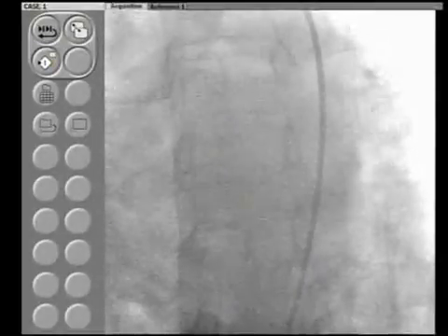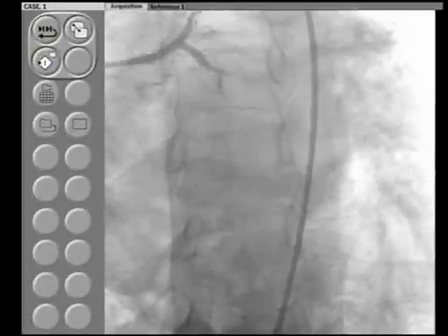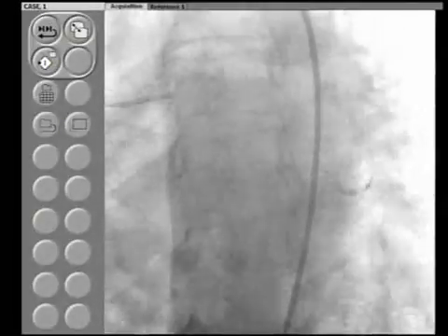Yes, disappointing from the OM point of view, but somehow we say that yes, we do the best thing, and sometimes that best is not enough at one point, but the second time should do very well. Go, very good. So you don't need to do anything to the OM.